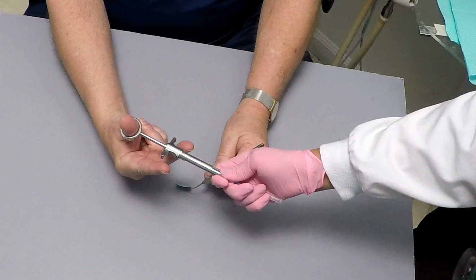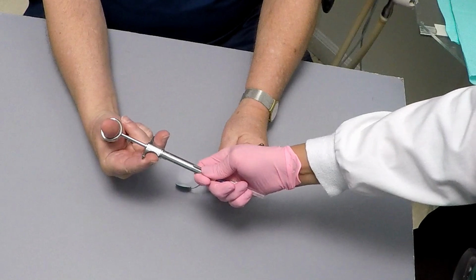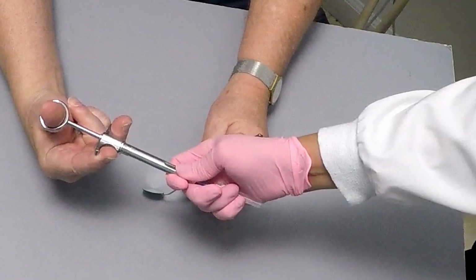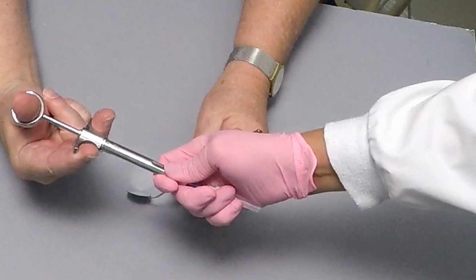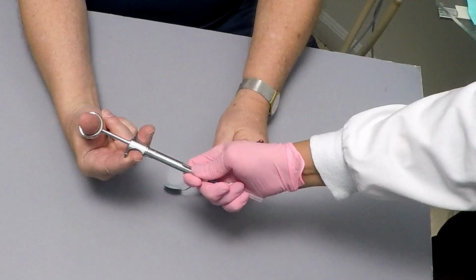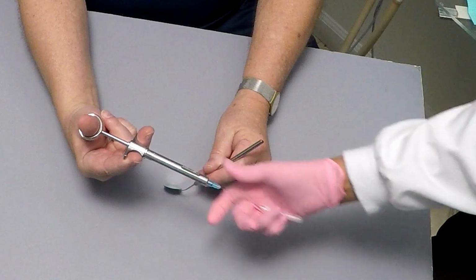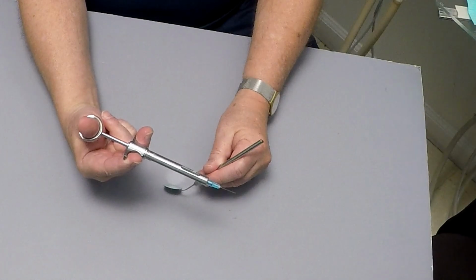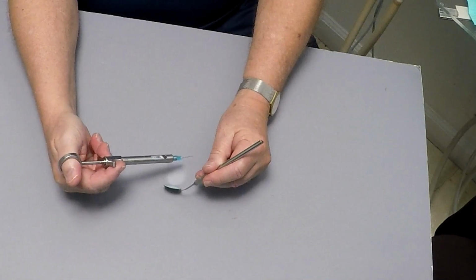She places the syringe, and you'll notice with her little finger, she has grabbed the needle sheath. It's already loose. She doesn't bring it over unless it's already loose. And then when she's able to remove it, I don't move until she has left the scene. There you can see she moves. Now I move the needle syringe.